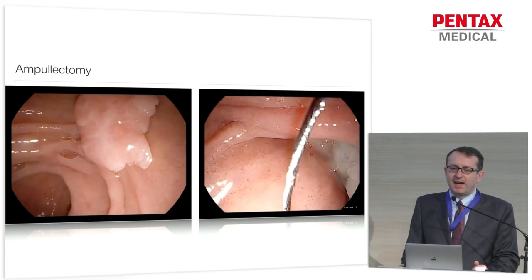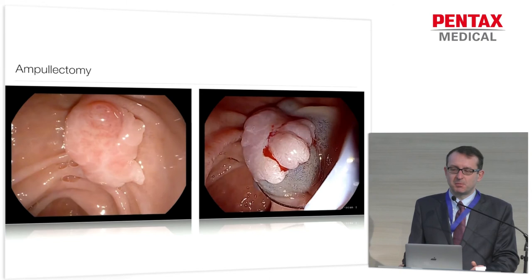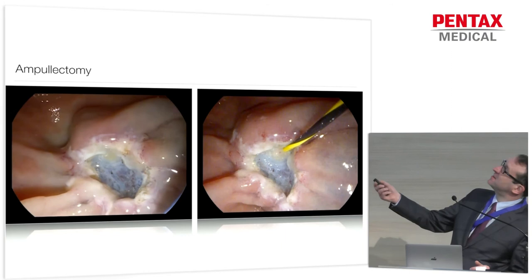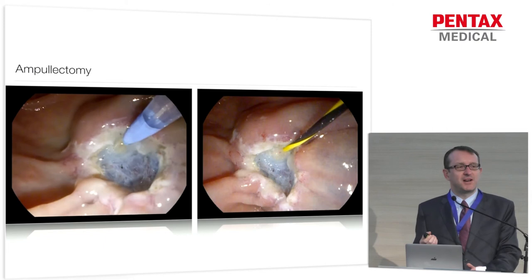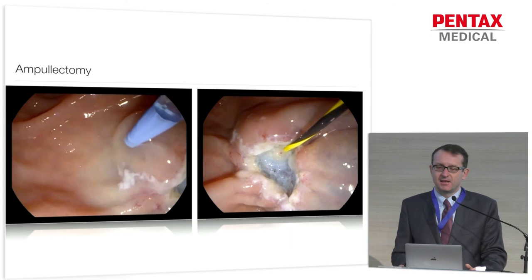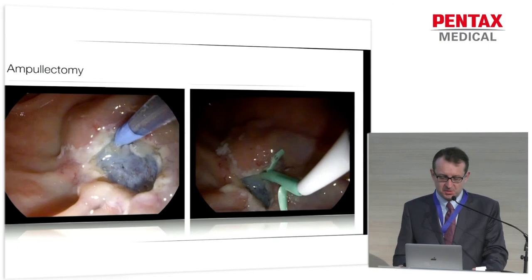This is another case of an ampullectomy we did. Again, the image resolution is excellent — you can see the papilla on top of the adenoma. On the right-hand side, we placed the snare after submucosal injection. The interesting part comes once you've resected it and want to place the pancreatic stent. As you can see, you can see the orifice clearly — that's very hard to do if you have a standard-resolution duodenoscope. It's so much easier to cannulate the pancreatic orifice with HD vision, place the guide wire, and then the pancreatic stent. Here you can drastically see the difference between standard and high resolution.